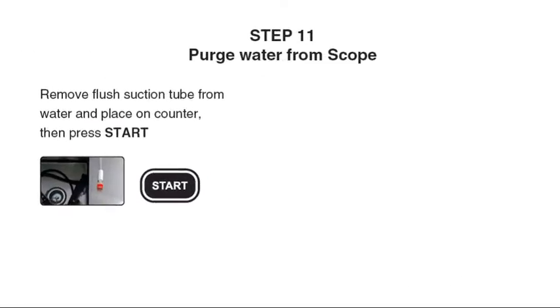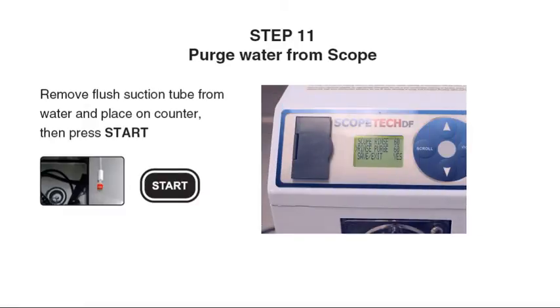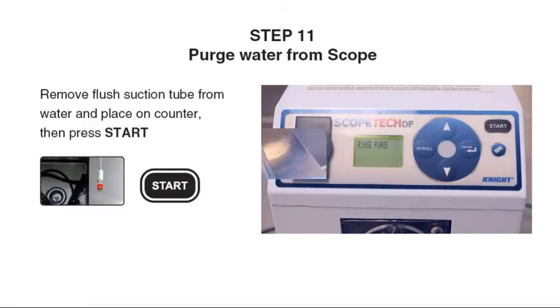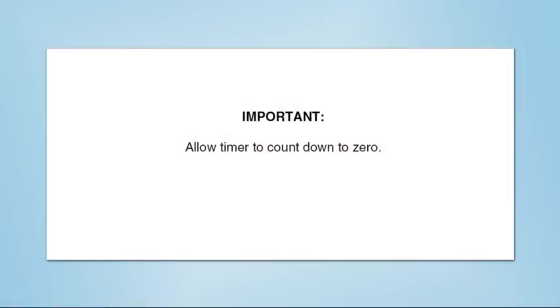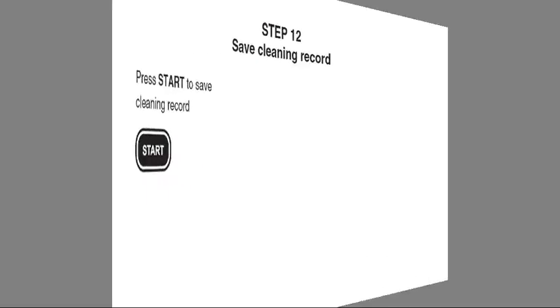Step 11: Remove the flush suction tube from the water and place it on the counter, then press Start to purge water from the scope. Allow the timer to count down to zero.